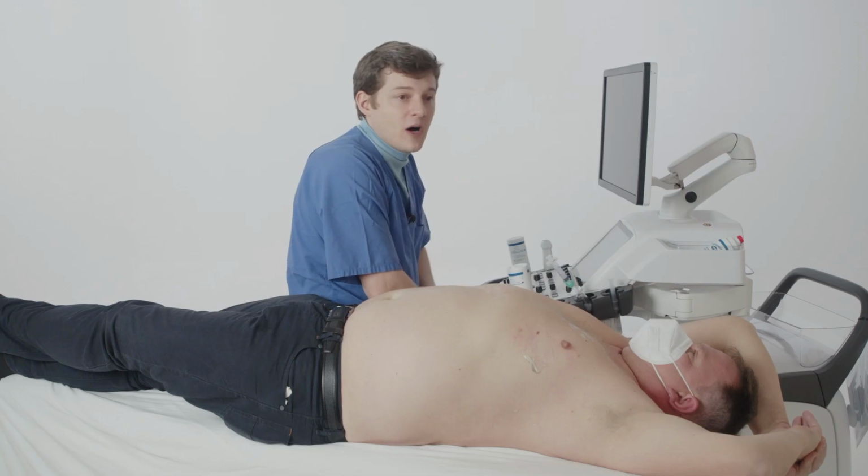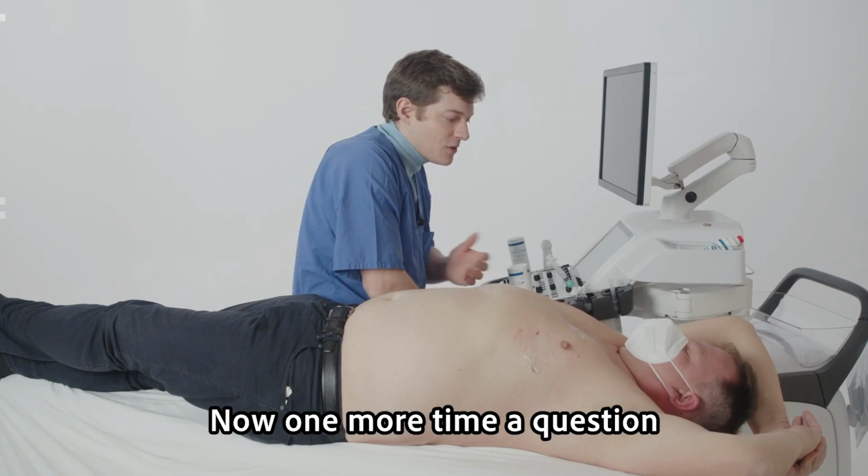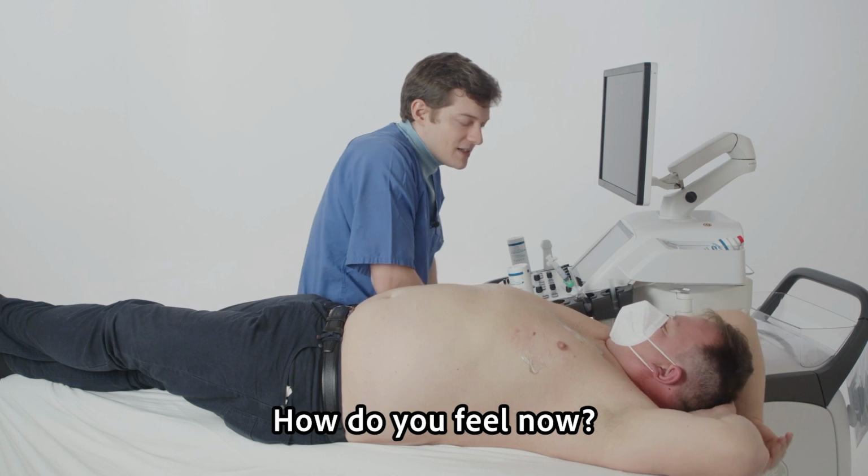We still are going to measure all our measurements, but now it's, for me, very important as we have the patient here, and he's receiving a new medication for the form of hypertrophic obstructive cardiomyopathy, Mavacamten. I want to ask him how he's doing. Also, jetzt noch einmal die Frage, wie geht's dir jetzt?